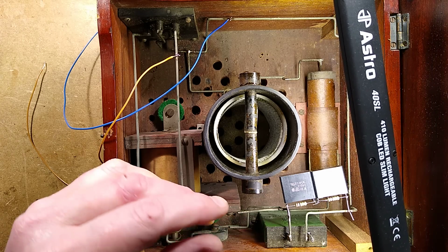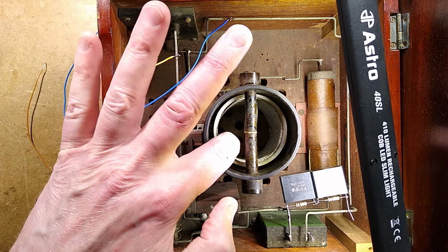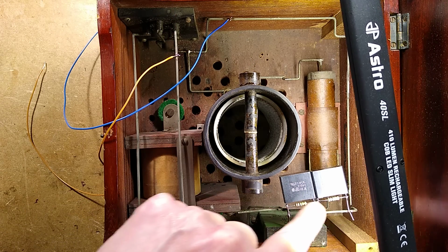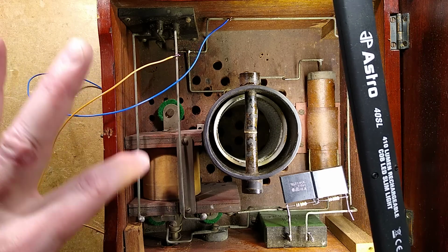It was showing 220 nanofarad, not producing great results. That might actually be down to dirty electrodes, but I've replaced it with two 1 microfarad capacitors in series to give 470 nanofarad, with discharge resistors across them and equalization resistors. Now there is a coil in here.